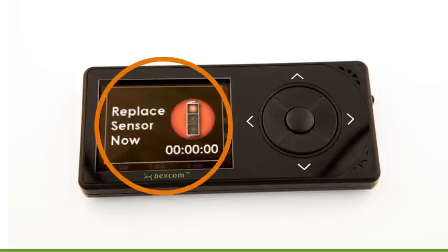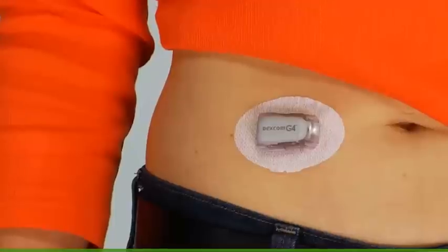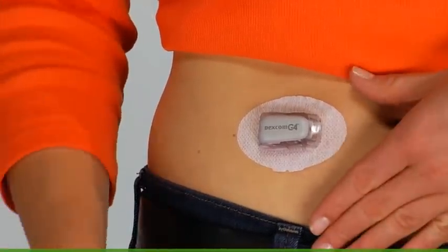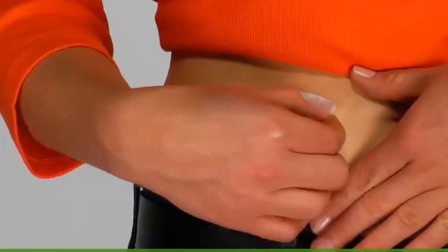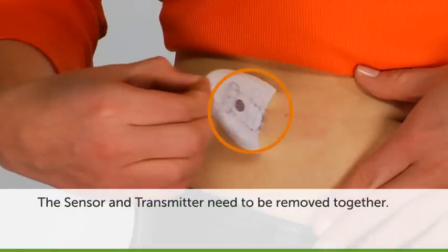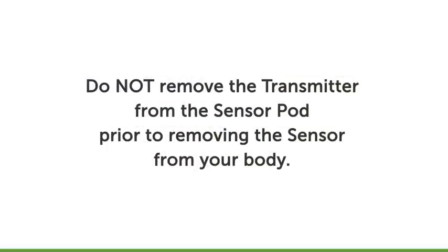When you see this screen, it's time to remove your sensor and transmitter. Keep the sensor and transmitter attached to each other and peel the sensor pod from your body, similar to removing a bandage. The sensor and transmitter need to be removed together — do not remove the transmitter from the sensor pod prior to removing the sensor from your body.